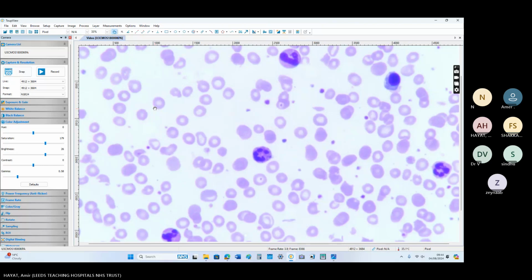I will urgently contact the medical team and so, you have now completed a segment of the report that the blood film shows RBC fragments, NRBCs, polychromasia with normal platelet count and increased neutrophils with toxic granulation.